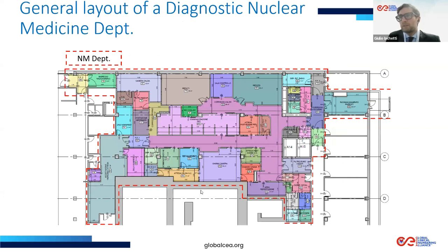Okay, here is just another example, a little more complex, considering a department with both PET-CT and SPECT-CT. So two different modalities in nuclear medicine.